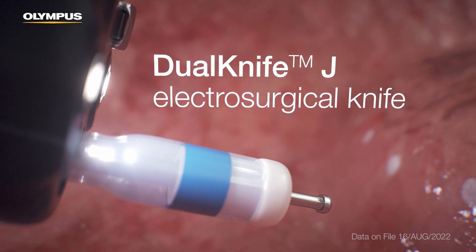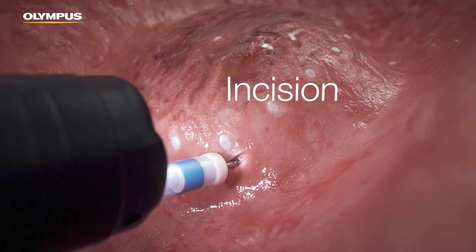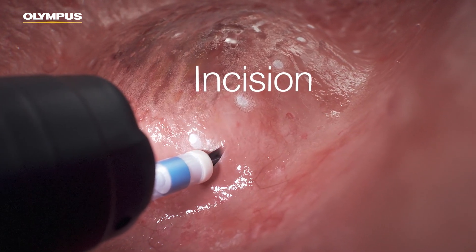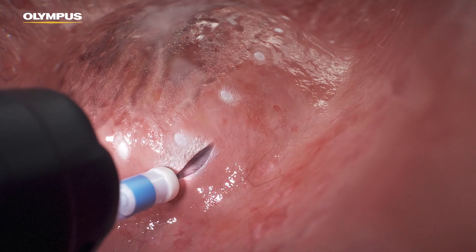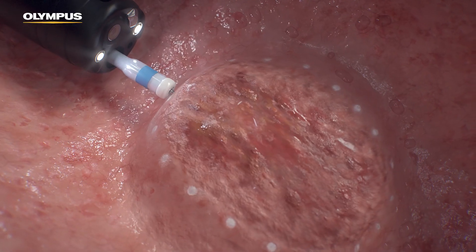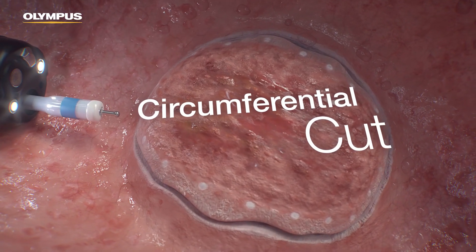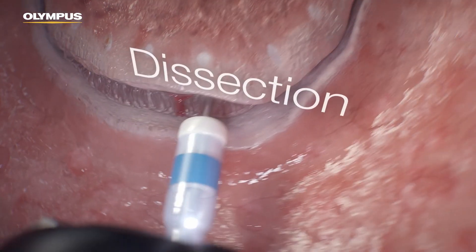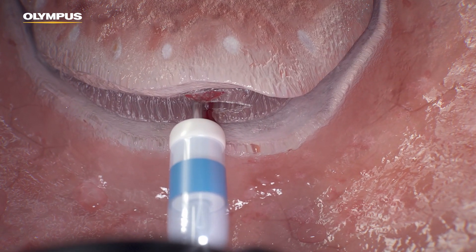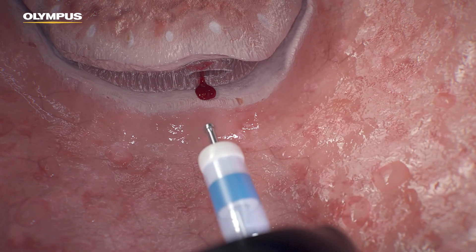The Dual Knife J Electrosurgical Knife is used to make the first incision outside one of the markings, creating a point of access into the tissue and starting the circumferential cut. The knife is then guided through the submucosal space, maintaining a cutting plane parallel to the muscle layer. Should bleeding occur, a hemostat is used.